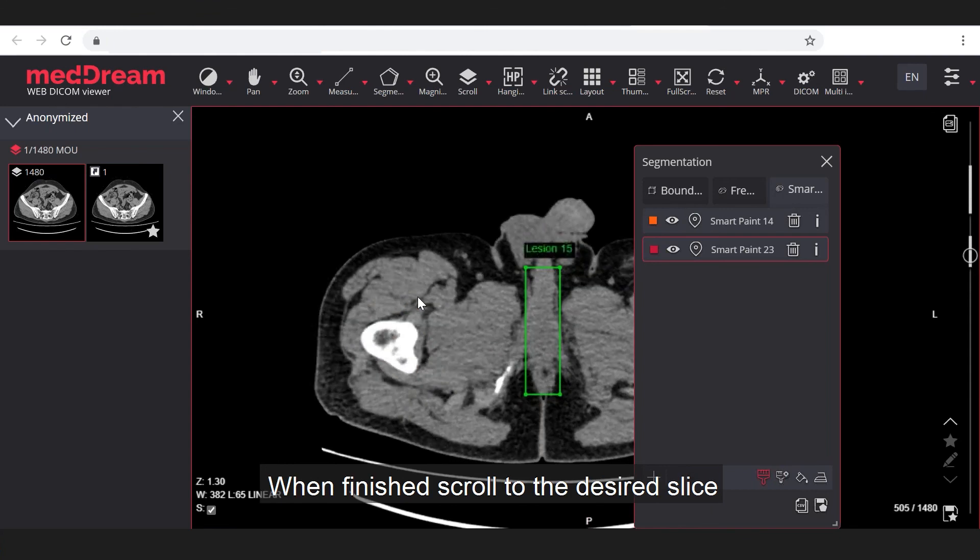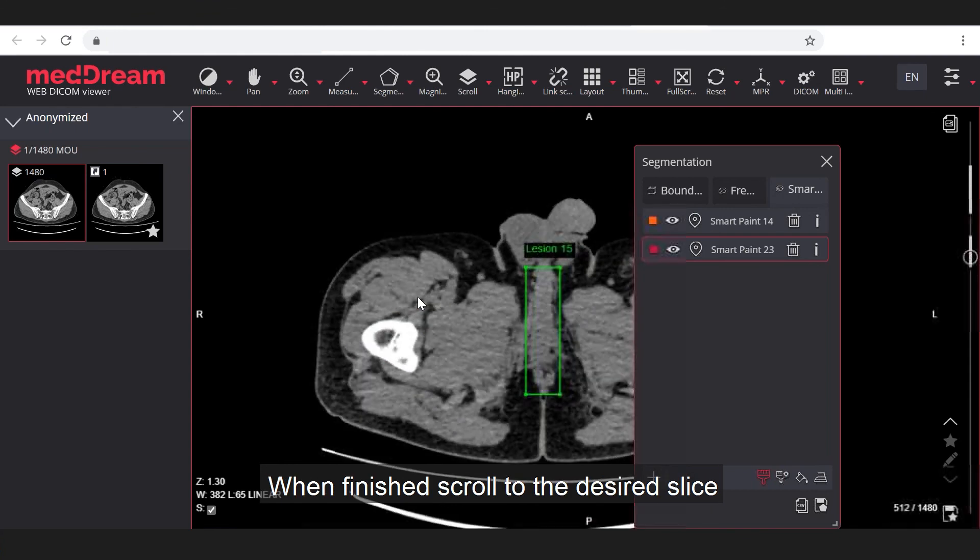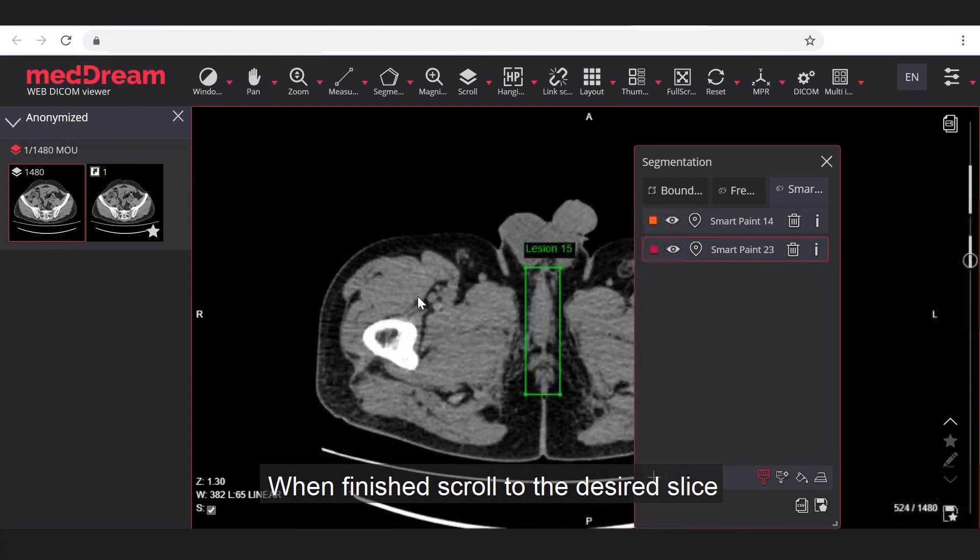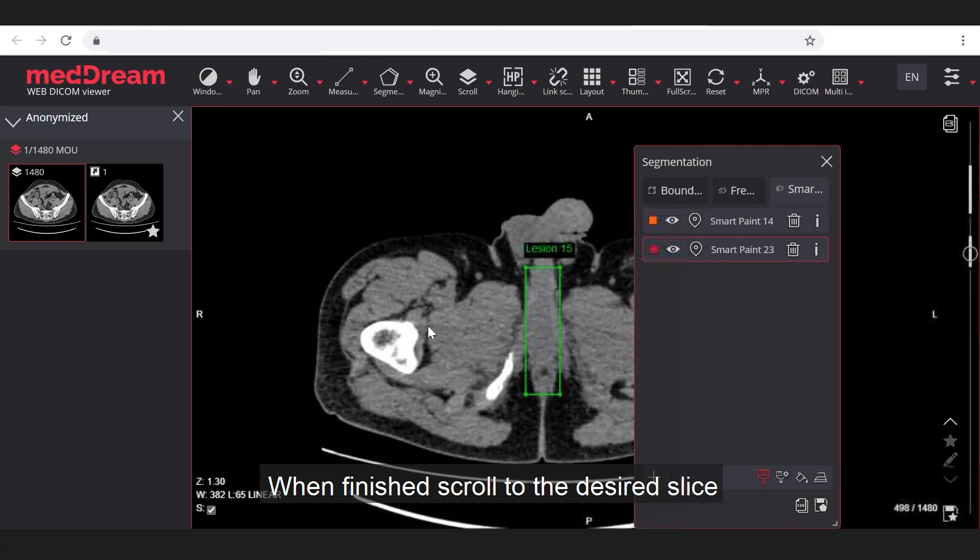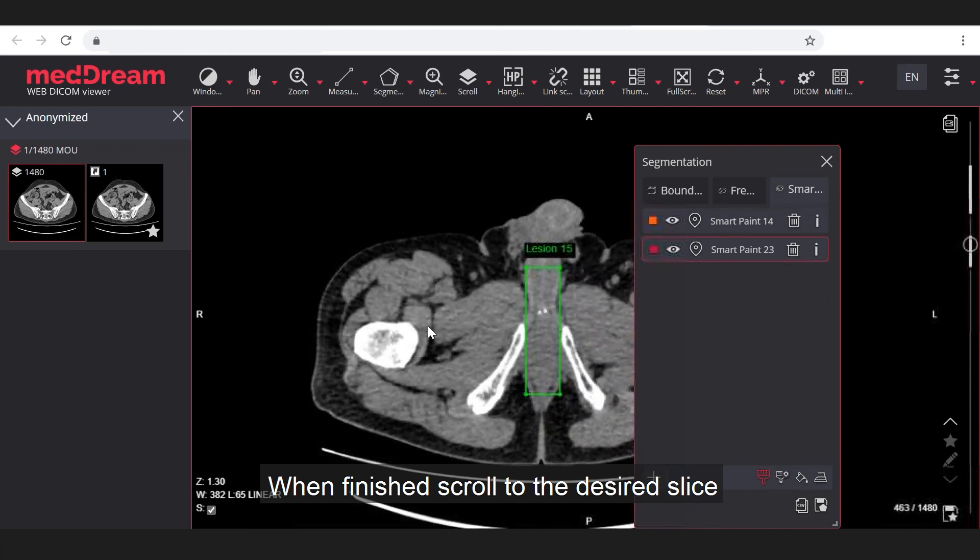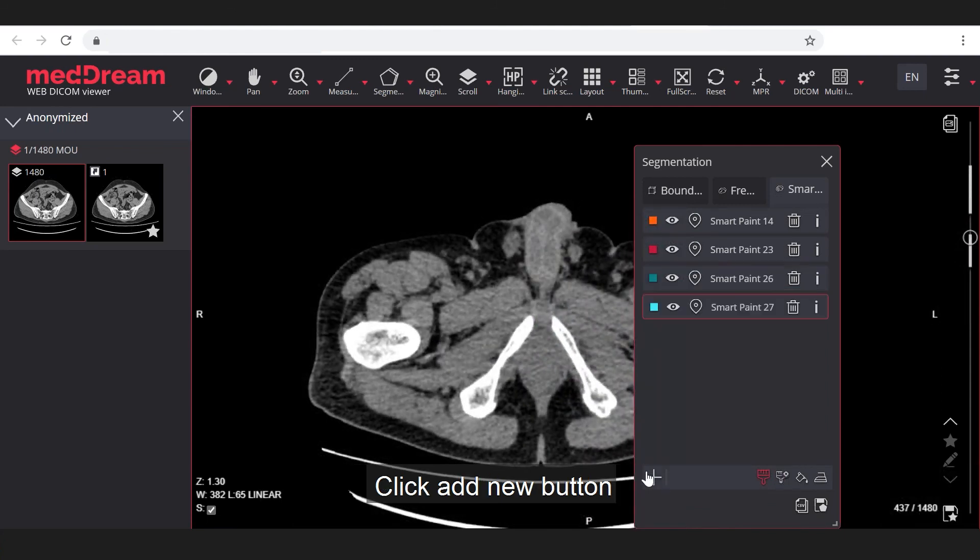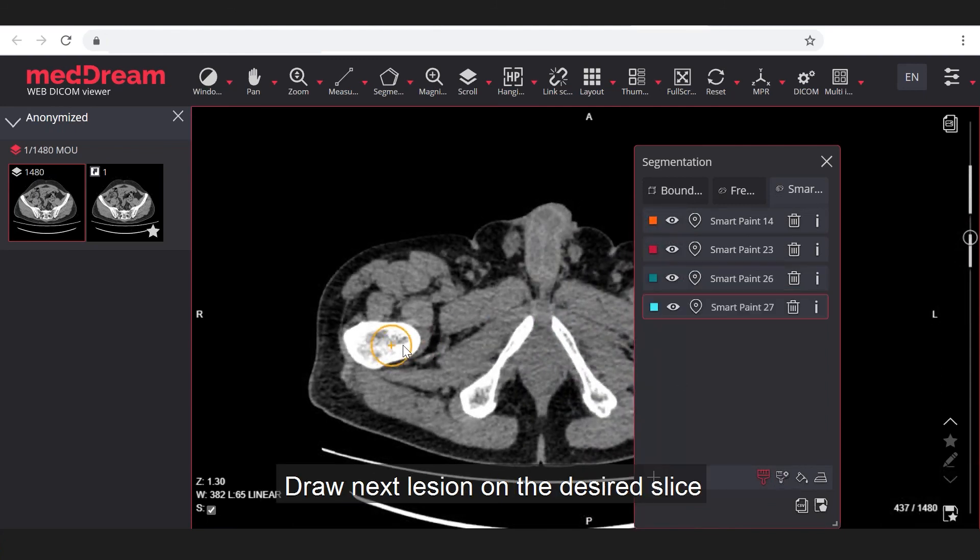When finished, scroll to the desired slice. Click add new button. Draw next lesion on the desired slice.